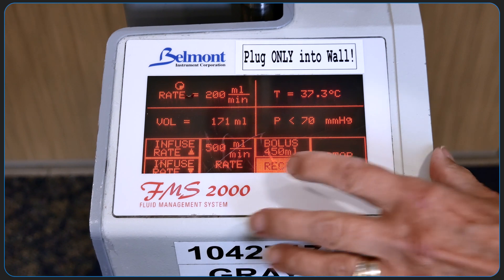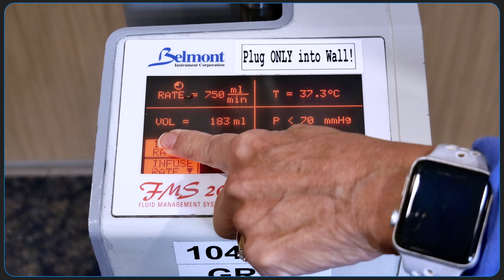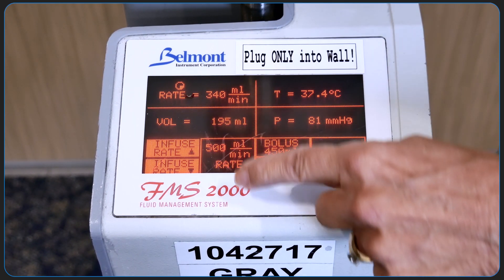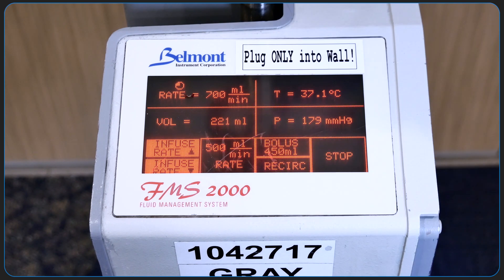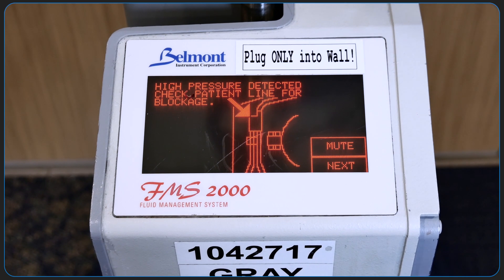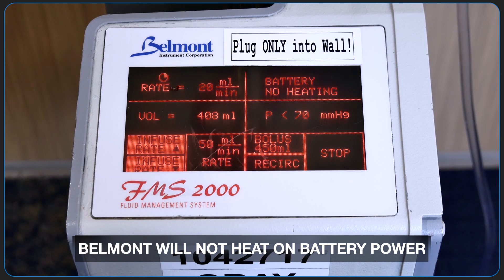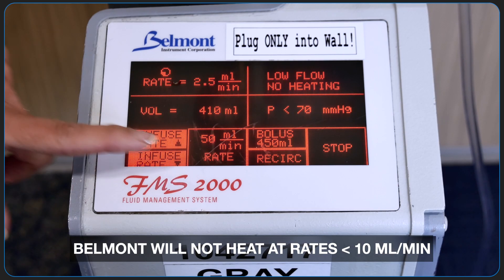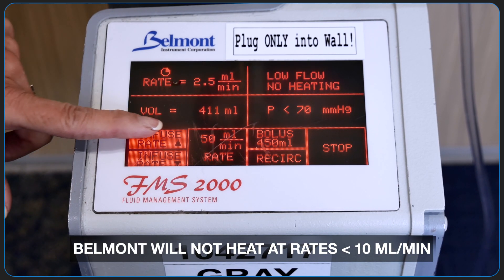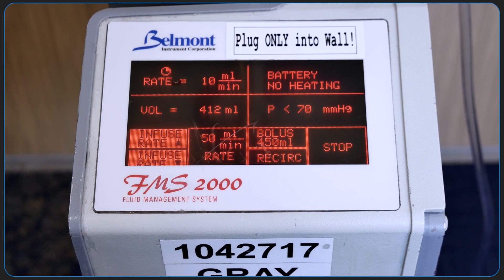Now let's ramp this up to see how fast we can get. This particular model maxes out at 750cc per minute. If you have a kink in the tubing or other downstream obstruction, you'll be given a high pressure detected warning. If you're using the Belmont without AC power, it'll show 'battery, no heating' in the top right. You'll also get no heating with flows of anything less than 10cc per minute. Once you get back to 10cc per minute and connect it to AC power, the Belmont will again start to heat the solution.